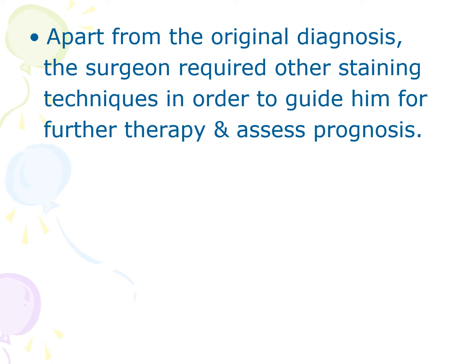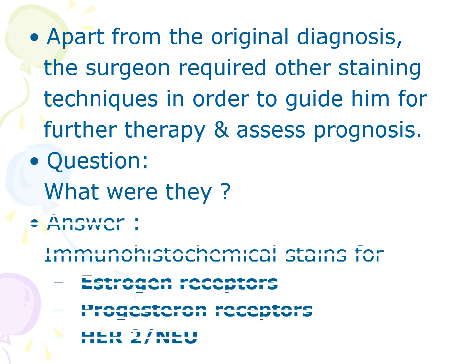Apart from confirming diagnoses, microscopic slides can be stained with immunohistochemical stains to guide the treating physician in therapy and to assess prognosis. In breast adenocarcinoma, the stains that are used for these purposes are estrogen receptor, progesterone receptor, and HER2/neu receptor.